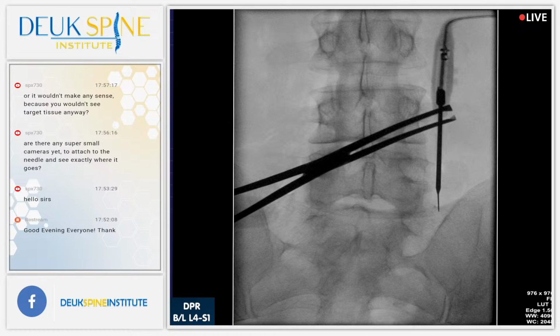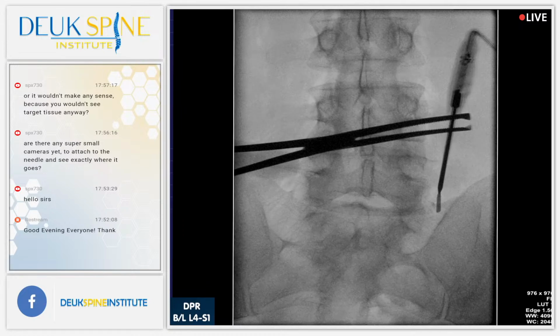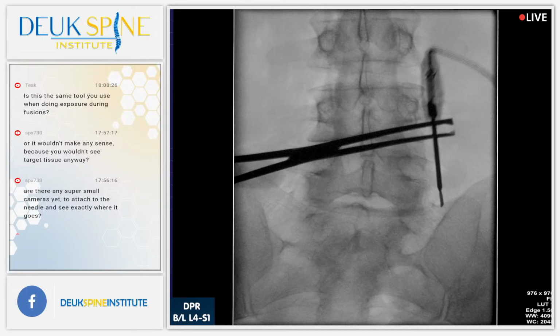Let's just see where that is. Hold on. And shot. Oh yeah, it's nice. I need to go more medial a little bit. There we go. That's better. Shot. I could feel the fascia release. Beautiful. And I'm literally dancing right where that bad nerve, that pain nerve would be. Let's just take one more picture. Shot. I want to go a little more medial. So I feel good. Hopefully that does it for this gentleman.